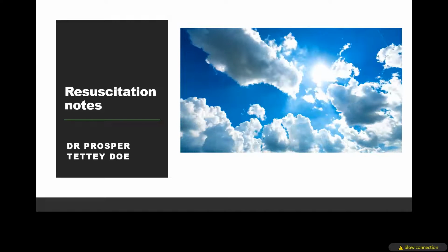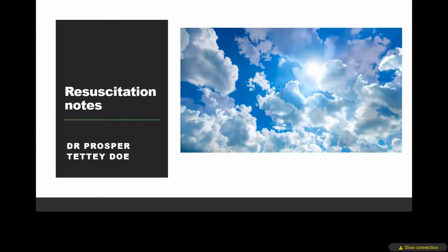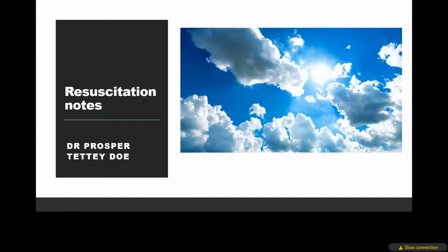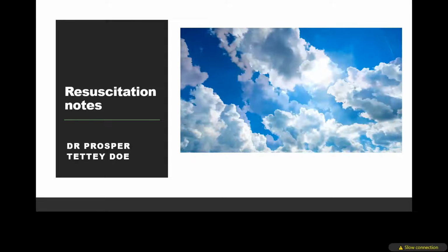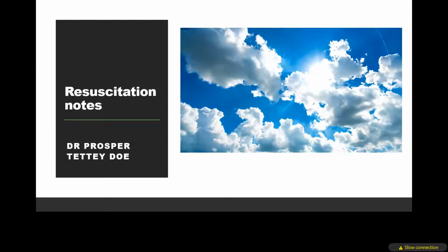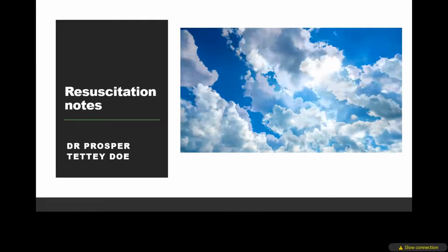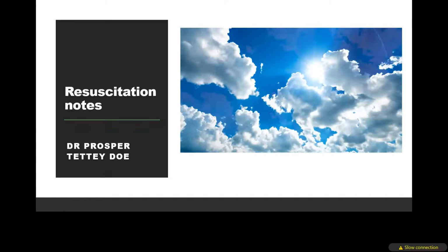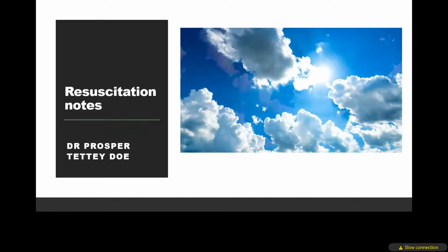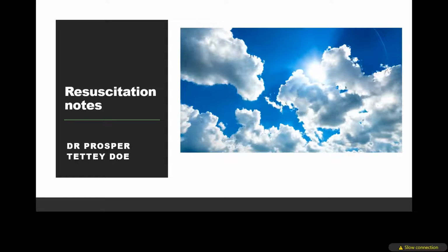How to operate. If you come across someone who is not breathing or breathing erratically, your priority is to call the emergency services on 112/999 and then start CPR to keep the blood flowing around the body. After a cardiac arrest, every minute without CPR and defibrillation reduces someone's chance of survival by 10%. If you're on your own, don't interrupt the CPR to go and get a defibrillator. When you call 999, the operator can tell you if there's a public access defibrillator nearby.